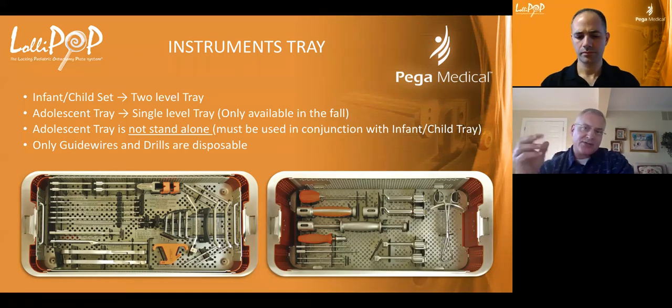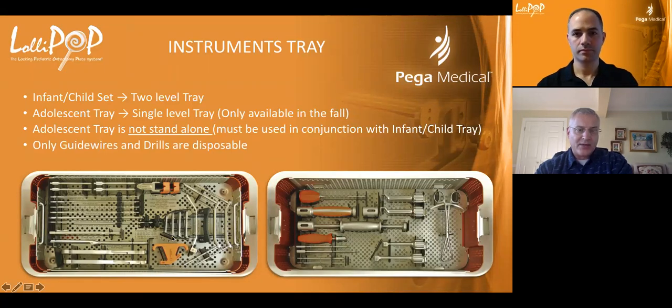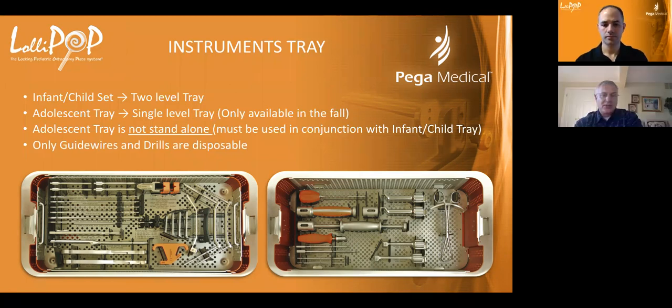And every set has your special instruments. I really like the metal triangles, and we have triangles for different angles, even though you don't have to do that. If you're kind of old school, you still want to do that. Our triangles are here. We have different osteotomy guides. This is a neat little invention of Fadi's for that 1-1 wire, and we'll go through all this. But we really tried to make these standalone trays. Everything you possibly could use in a proximal femoral osteotomy is kind of contained in these trays.